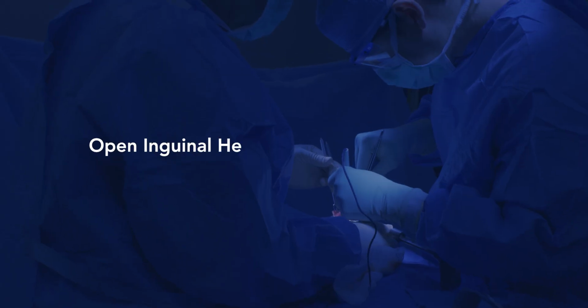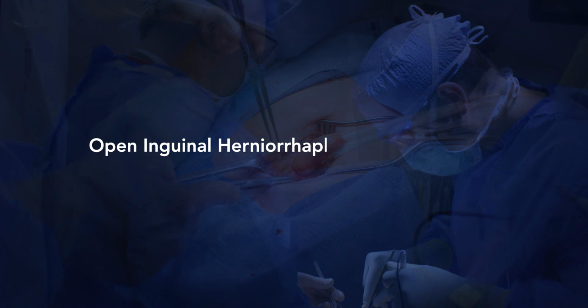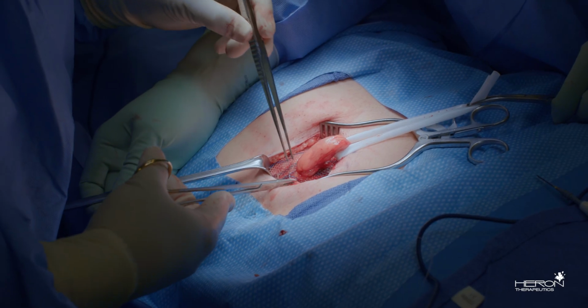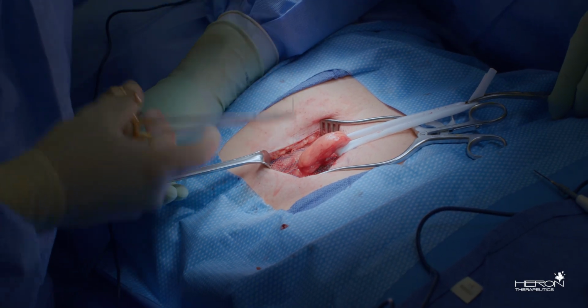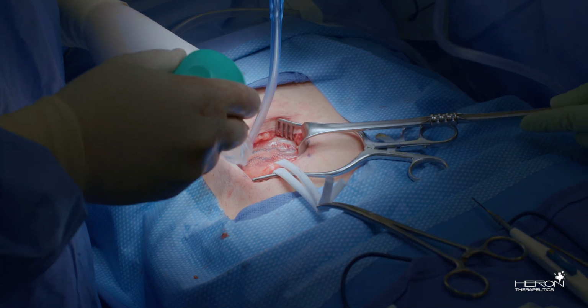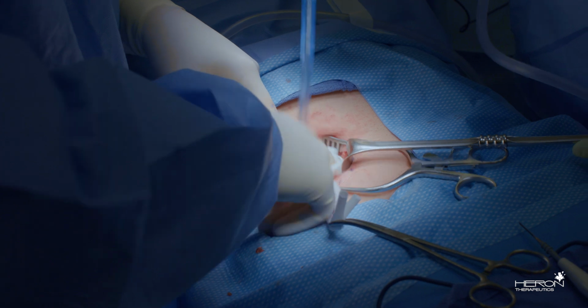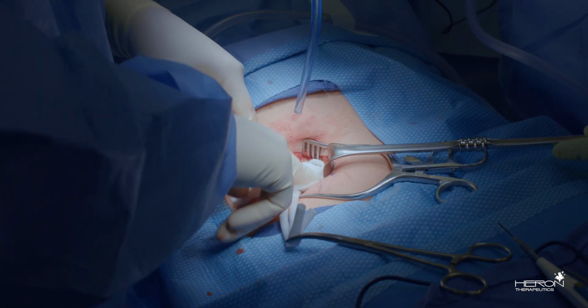In this video of a Lichtenstein repair of a right inguinal hernia, the patient's head is to the left and feet are to the right. The product is prepared by the scrub tech and the circulating nurse before the operation begins so that it's ready for use. After the hernia repair is completed and the surgical site has been irrigated and hemostasis is ensured, the product is applied as the last step of the operation before closure of the incision.